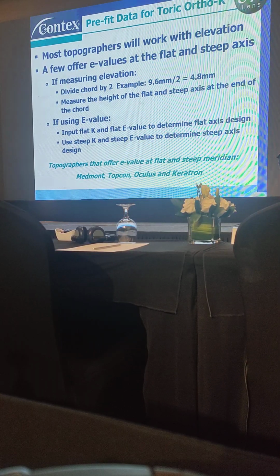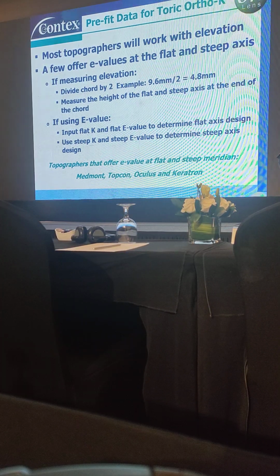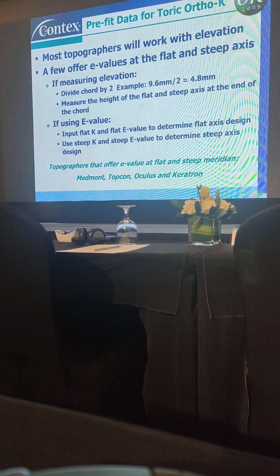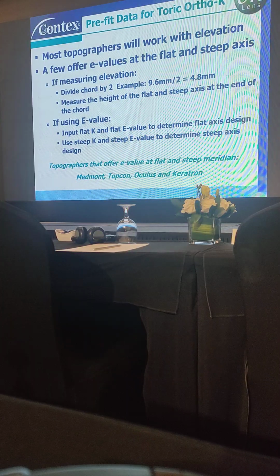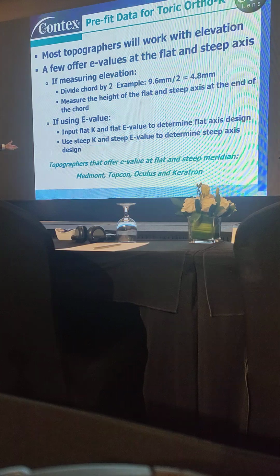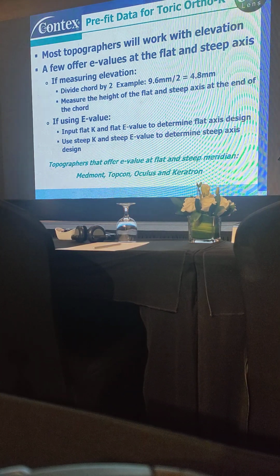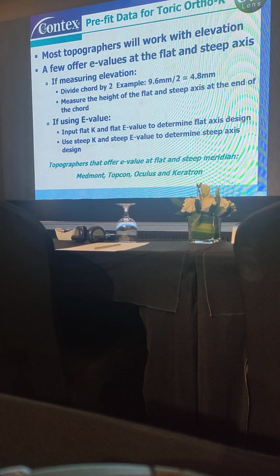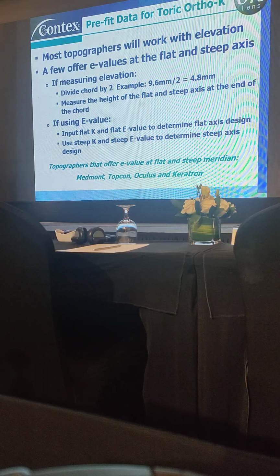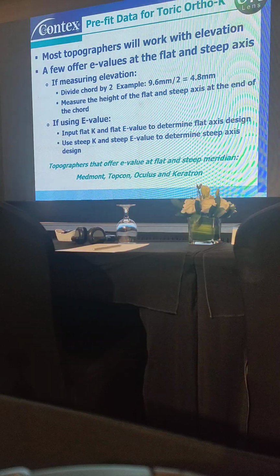So that's where I feel it's imperative, it's very important, that you have a topographer that can give you the eccentricity at the flat and the eccentricity at the steep. And I think that's about the 10th time I've said that today, right? So it is very important. The topographers that I know of that offer that flat axis eccentricity are Medmont, Topcon, Oculus, and Keratron, which is not so popular anymore, but it was a very good topographer in its day.